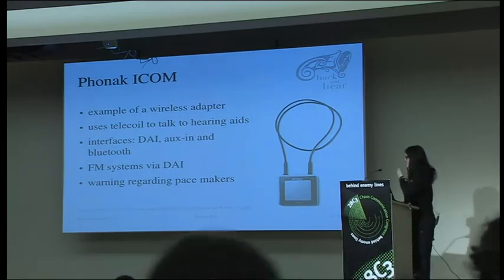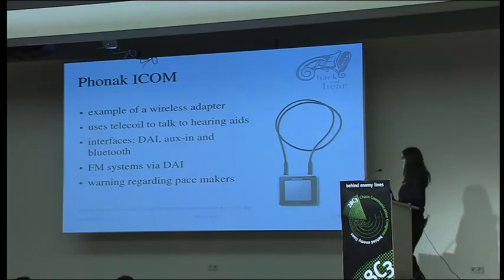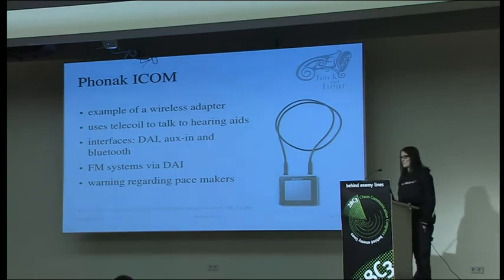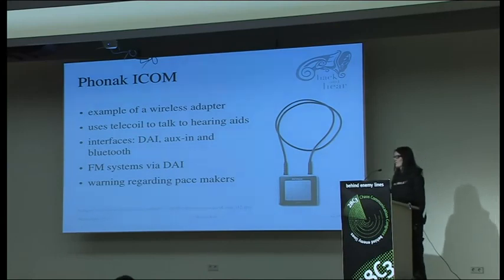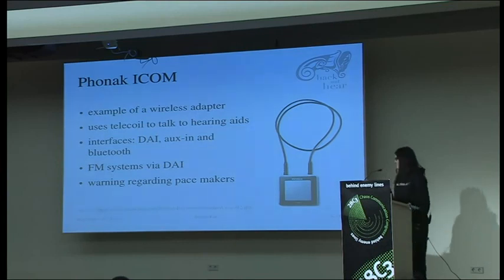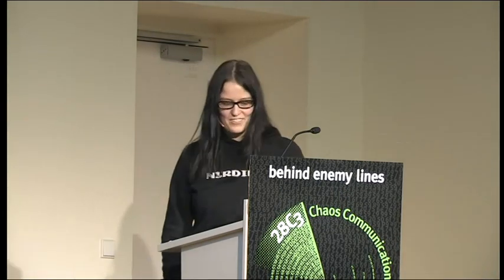I have a friend who has a pacemaker and this thing. He just ignored the warning, but luckily, he's still alive. I think this is a good example of where we are heading in the future. We will get more and more cyborgs, and I doubt that every hearing aid vendor is testing the adapters with every pacemaker there is. So we will get a lot of compatibility problems in the future. And if this really works, it might be an option to kill people really, really silently, remotely. You have to think of that.